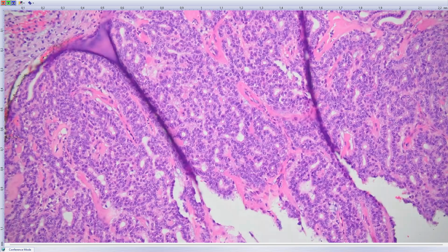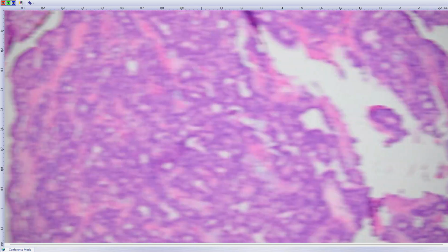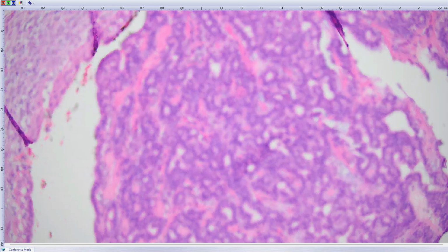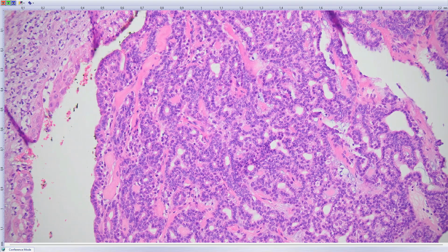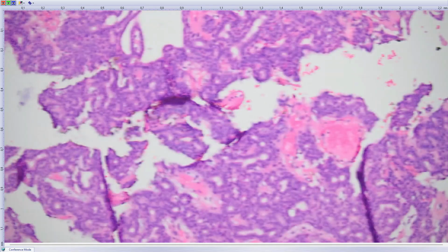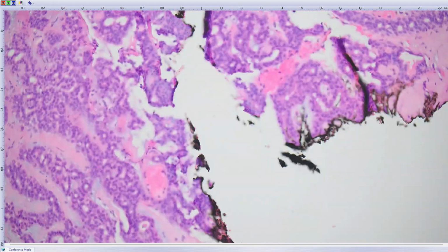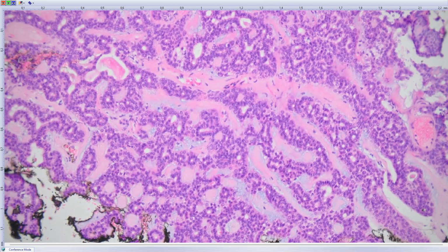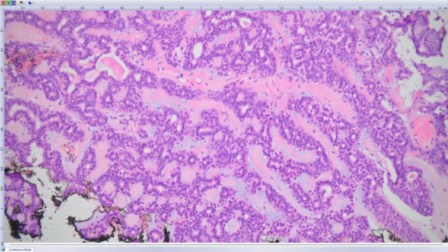So what you can see here, maybe that's all that I can demonstrate. Some fibrous septa, a little bit of tubular trabecular growth pattern. And why I'm demonstrating it, do you have an idea what it could be? Yeah, I think very nicely you can see fibrous septa with a little bit of myxoid transformation of the hyalinized matrix. So that's what we have.